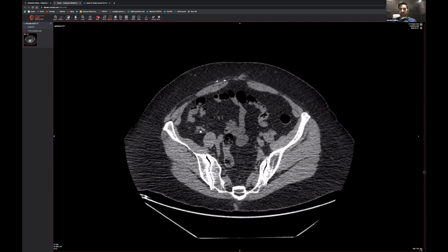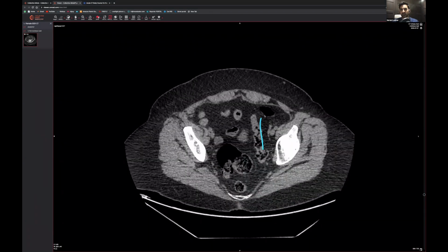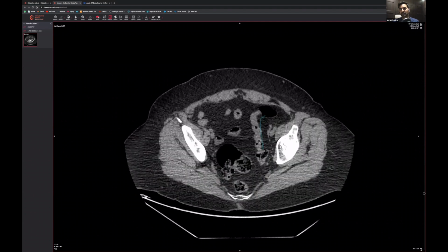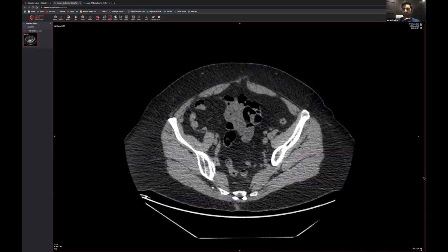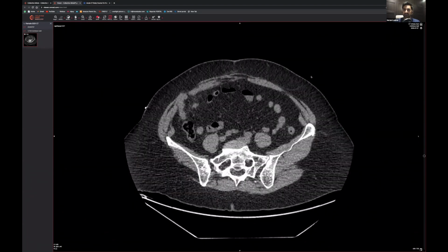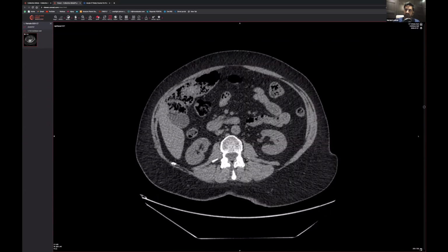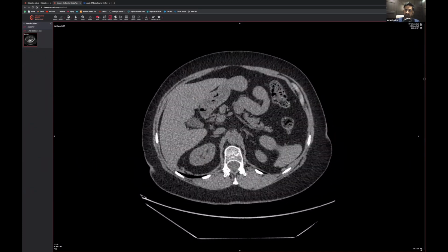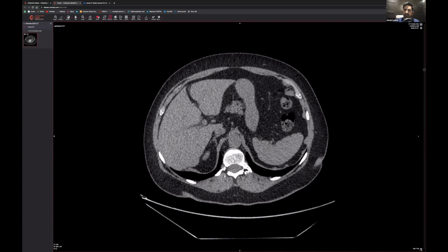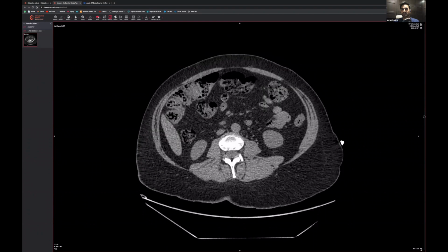Sigmoid colon that way. Oh, sigmoid colon veers off this way. Okay, goes this way, all the way this way. Still looks okay. No, not much in the way of inflammation. Now we come to one of the constants. We can see the constant is going to be this guy over here, which is going to be the descending colon, coming all the way to the top. We come to the splenic flexure, and then going across to the transverse colon, all the way across like so.